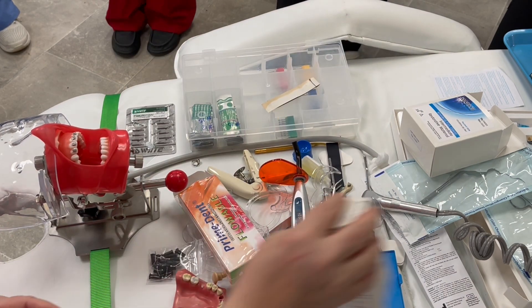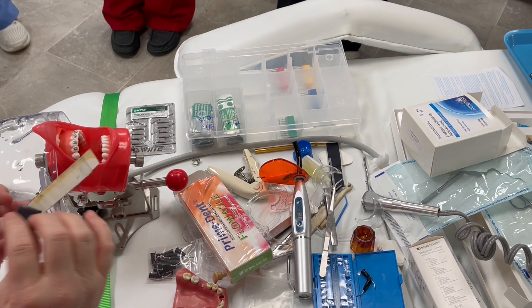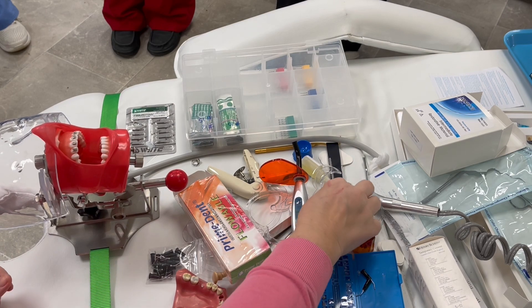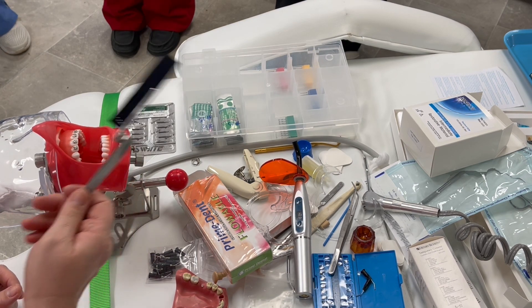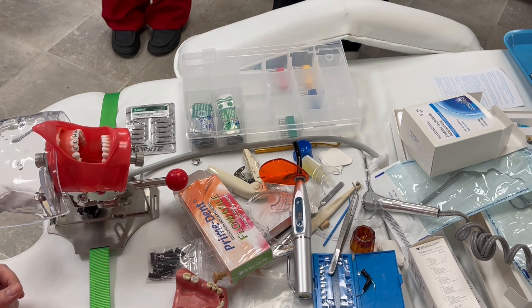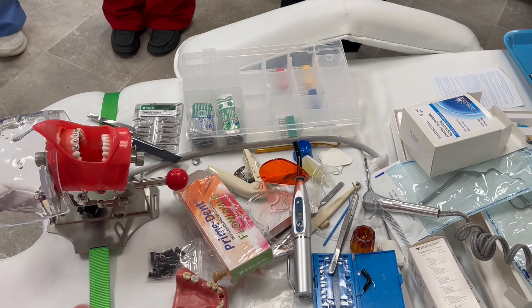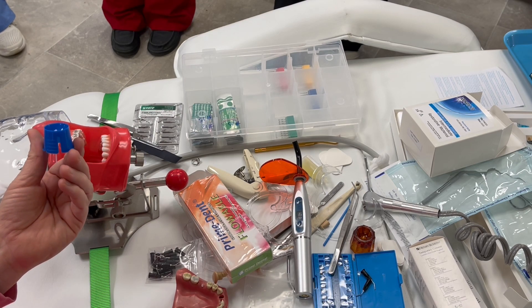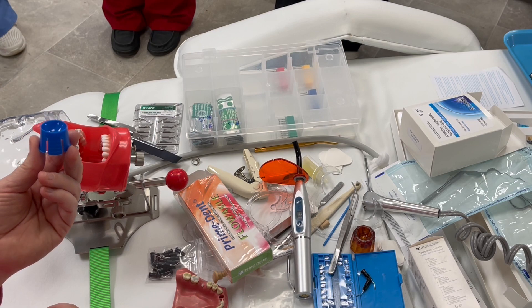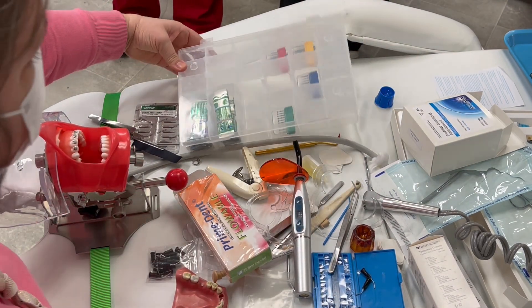So we've got our articulating film — articulating paper or film. What instrument do I put it in? What was this called? A Miller forcep. Are you the one taking notes? Extra credit. So what was this other thing called? You put the sealant or etch in it — it's just a little dish. It's called a dapping dish.